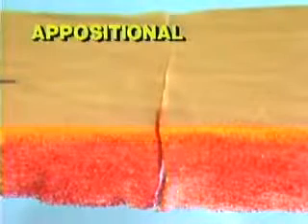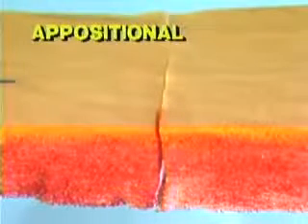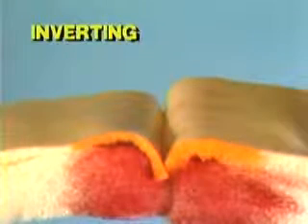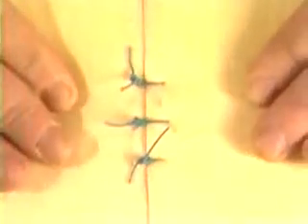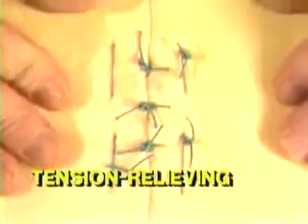Additionally, suture patterns may be classified as first appositional, bringing individual tissue planes into anatomic alignment. Second, inverting, turning tissue inward toward the patient or toward the lumina of a viscus. Third, everting, turning tissue edges outward toward the surgeon. Or fourth, tension relieving. In this model, a non-tension relieving suture gaps when pressure is placed on the tissue. In this model, note how the addition of a tension relieving suture has removed the tension forces from the wound.